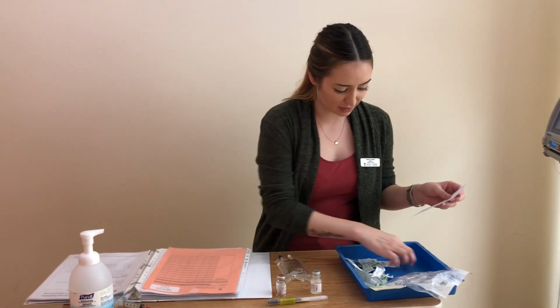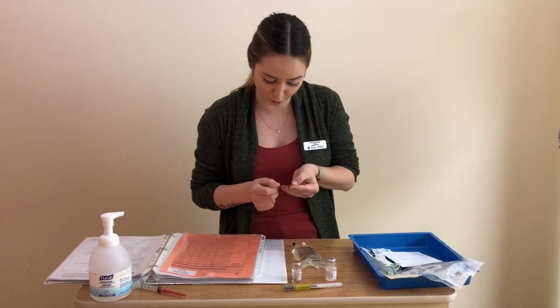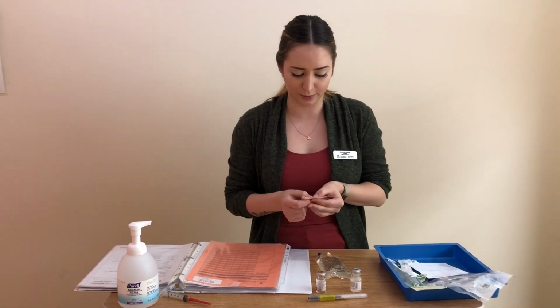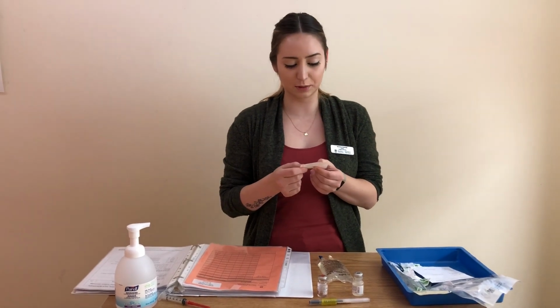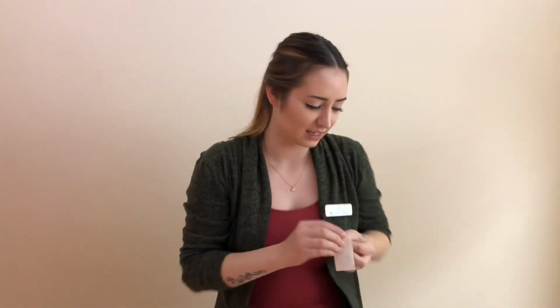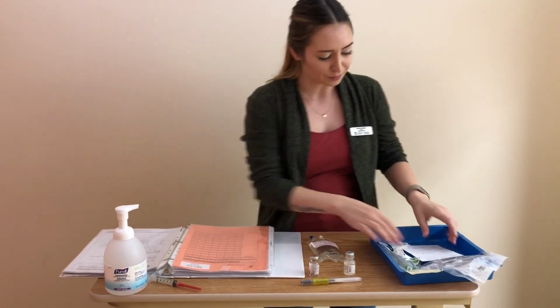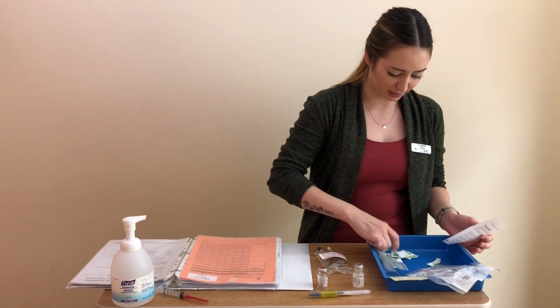And I'm going to attach a med label, which I've already made. It's for Emma, methylprednisolone, dose is 75 milligrams, which was 1.2 milliliters in a 100 milliliter mini bag. So the concentration is 0.74 milligrams per milliliter. Just zoom in on that for you. So I'll attach this to the bag. Now I'm going to get ready to go to the bedside. So I'll gather my supplies.